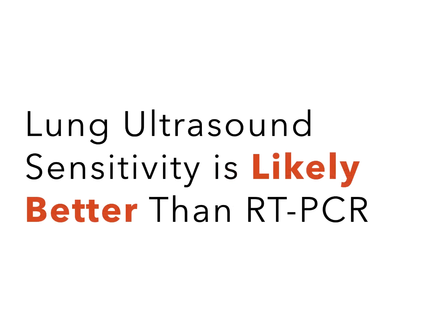So this is where ultrasound steps in. Extrapolating from the COVID CT studies that are in the literature, lung ultrasound sensitivity is likely better than PCR testing. It's also likely better than chest X-ray. Again, this hasn't been formally studied, but this is extrapolation from the CT data. As I mentioned earlier, the majority of patients have peripheral-based lung pathology, which is where ultrasound performs best.